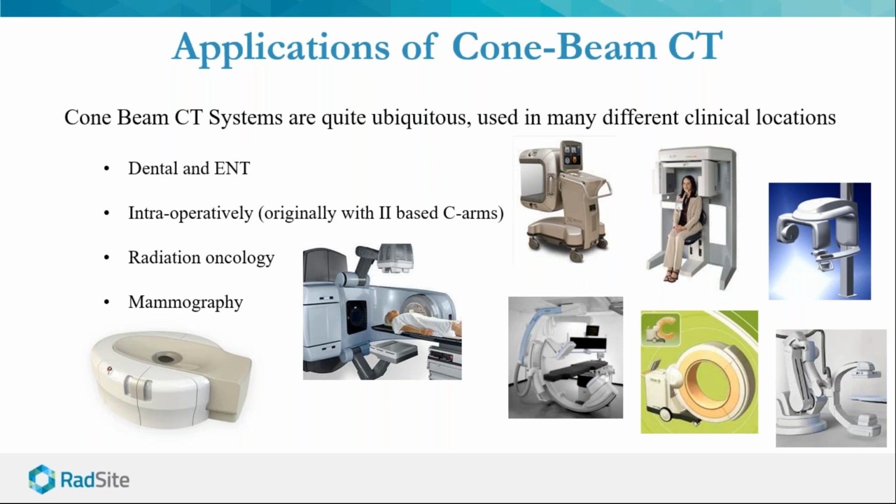If anyone has kids, particularly for the American audience, when they get their braces fitted, as they typically do, they'll normally get a cone beam image to understand just how much the treatment has to move the teeth around.